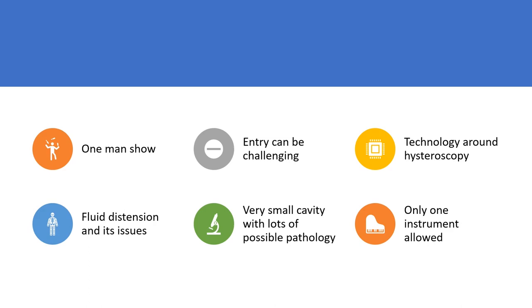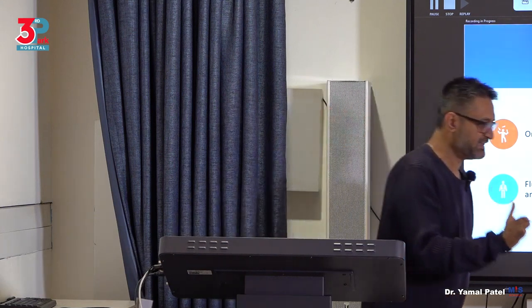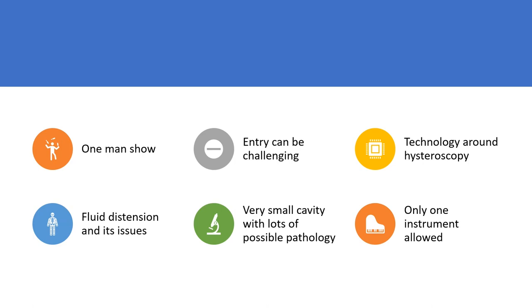Two, entry can be challenging. So you have to understand how am I supposed to take care of these challenging entry scenarios? You need to typically understand technology about hysteroscopy very well, because it has a very narrow safety margin. I've told you it's dangerous.